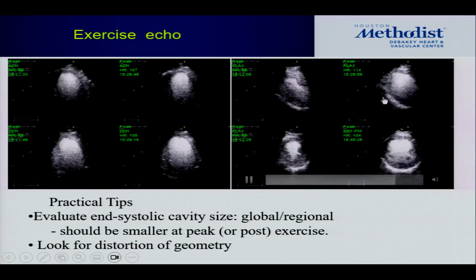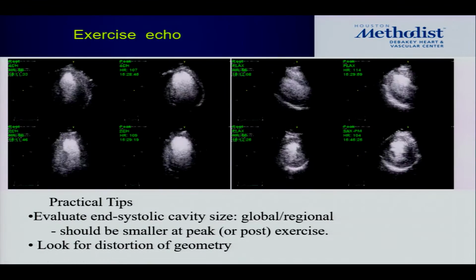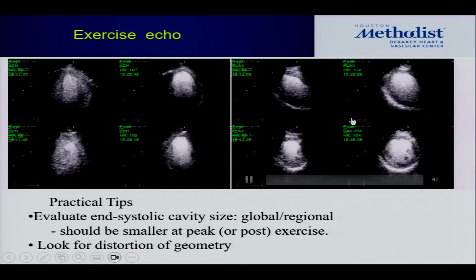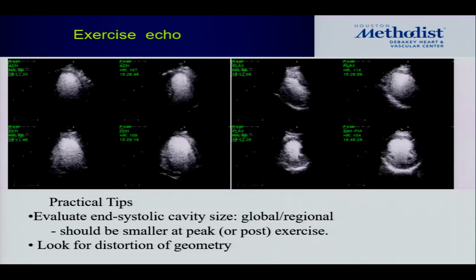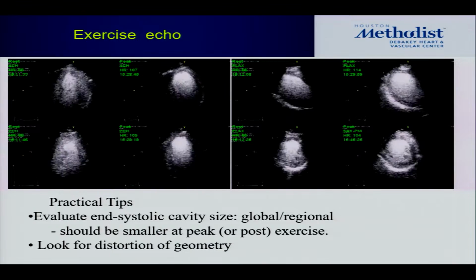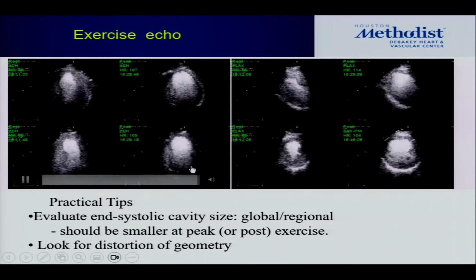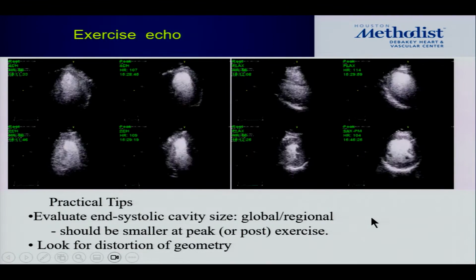So this particular beat, as abnormal as it looked, where you might think of a really bad thing, well, we probably have to throw it away, because unfortunately, it was captured right with the PVC. Those are some of the little things that sonographers need to pay attention to when you are capturing, because you can quickly recapture if that one didn't work out. But excluding that particular beat, still with the short axis and the apical views, there is an abnormality of contraction here in an LAD distribution.